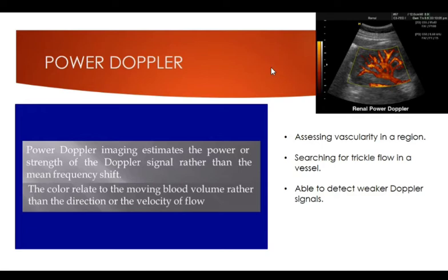Power Doppler is a little bit different to color Doppler. It's still built the same way though. And what I mean by that is that those beams are shot out, and there's 8 pulses, and then it's moving to the next step, and 8 pulses moving to the next step. So it's built the same way, but power Doppler, it's not the Doppler shift that's displayed.